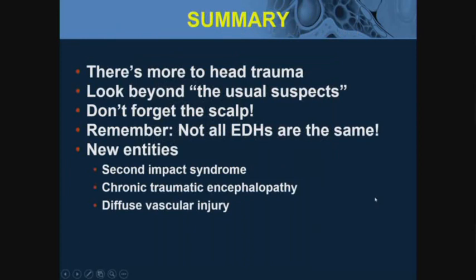So in summary, there's more to head trauma than we might suppose. We need to learn to look beyond the usual suspects. Don't forget the scalp. Remember, what we're looking at is predominantly subgaleal hematomas, which can be life-threatening in infants and young children. Remember, not all epidural hematomas are the same. Some that you worry about, the regular ones; the venous ones, and the vertex ones, the anterior middle fossa, the clival epidurals, are typically self-limited.